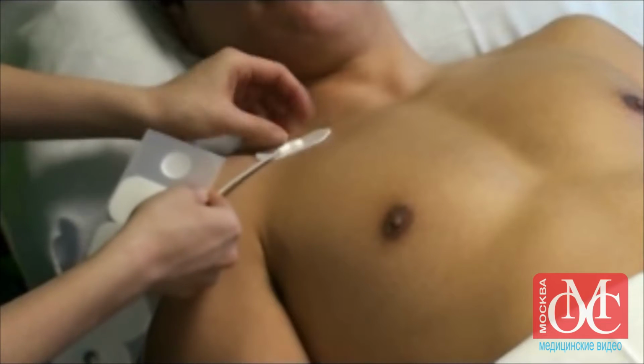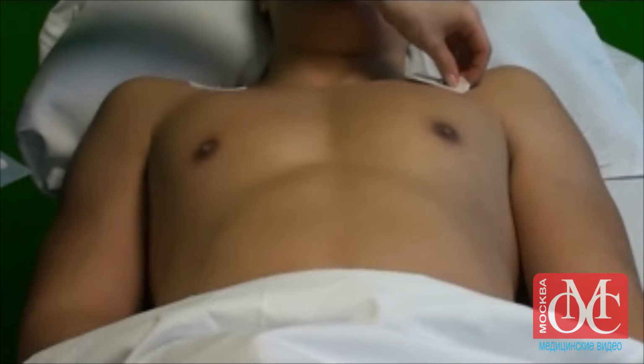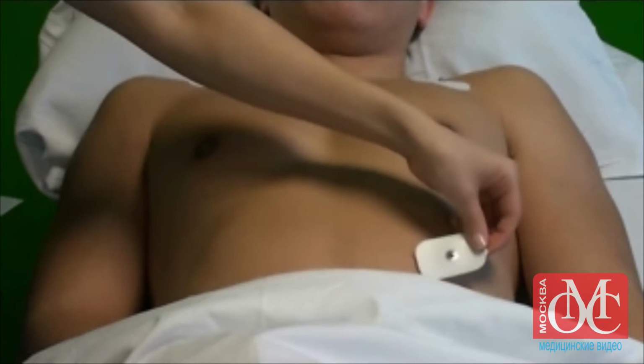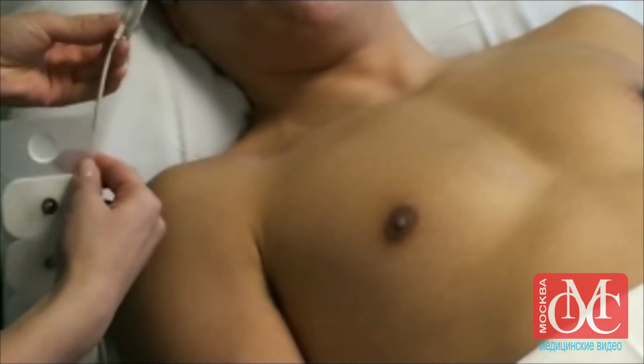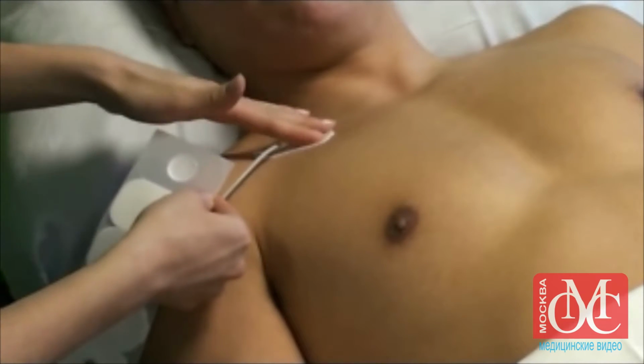If the patient is conscious, explain that the electrodes may feel cold. Place the electrodes with gentle downward pressure. To minimize the appearance of artifacts in the ECG, avoid bony prominences and major muscle groups when selecting sites for electrodes. If you are using snap-on lead wires, attach the lead wires to the electrodes before placing the electrodes on the patient's skin.